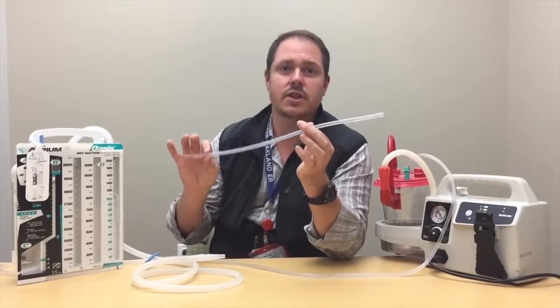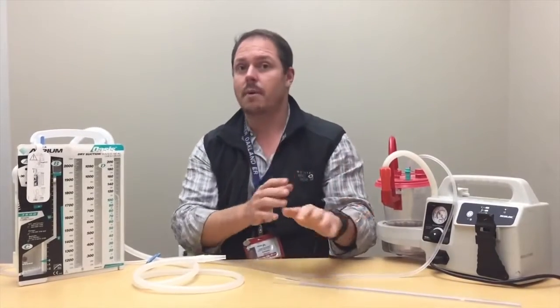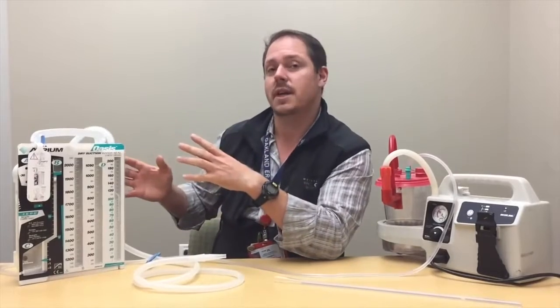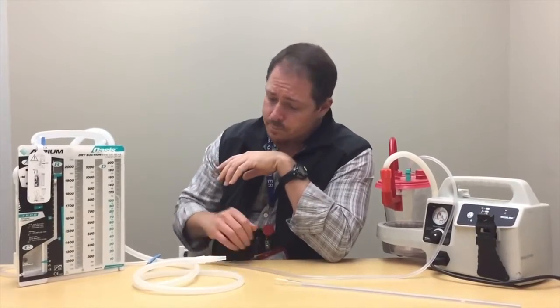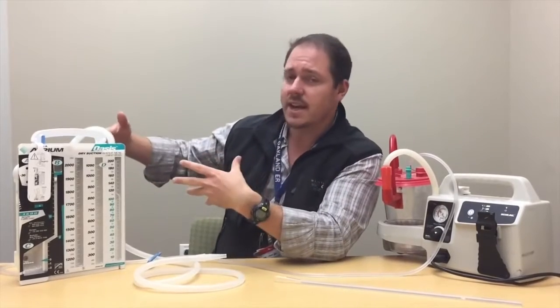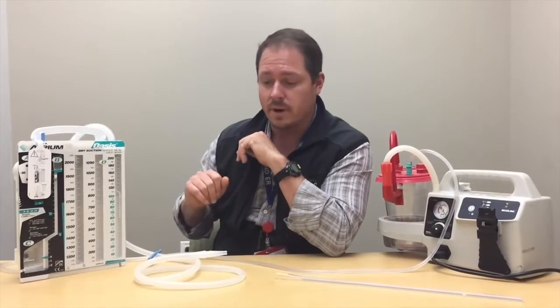The doctors are going to be busy putting in their chest tube — they'll be fully surgical, fully sterile — so we can kind of ignore that. As nurses, we need to get this piece set up so that we can begin to evacuate the pleural space the moment they're ready. This is the actual setup itself; I've taken it out of its sterile overwrap and will walk you through using it.